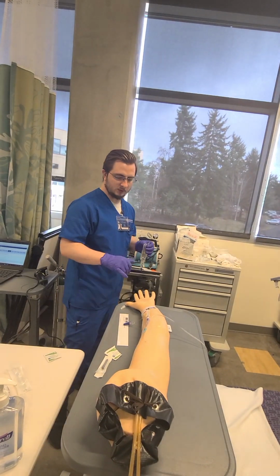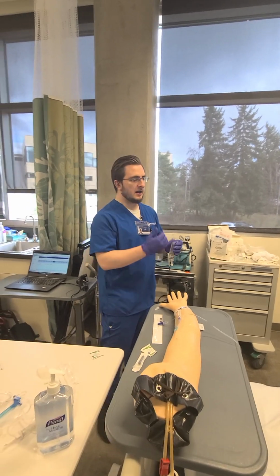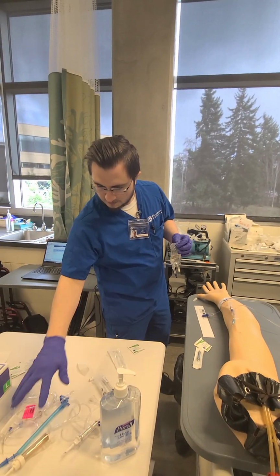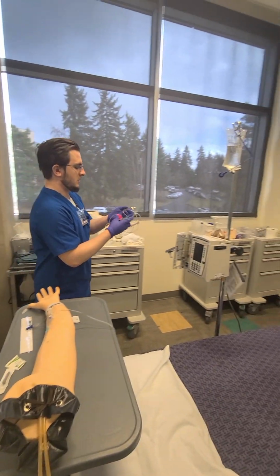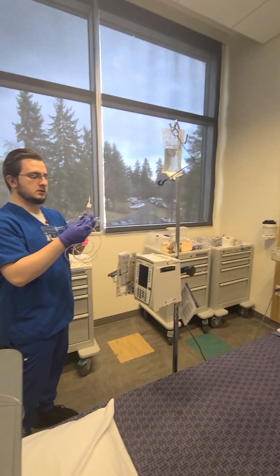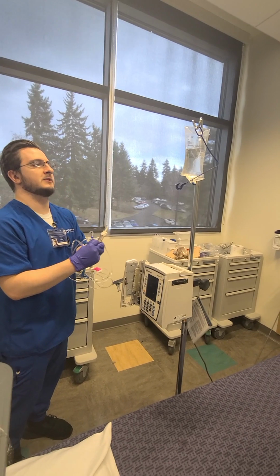It is, we're good. It's the right patient. It is the right time. And IV is the right route. So everything is good. Get my primary tubing. Leave my secondary here for now. Got this. Make sure it's clamped down.